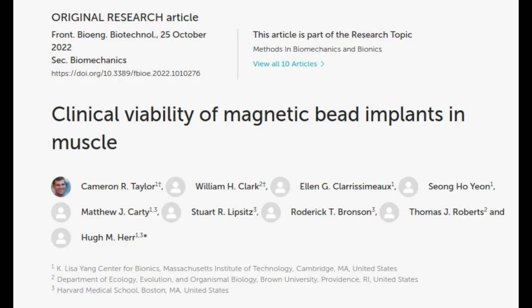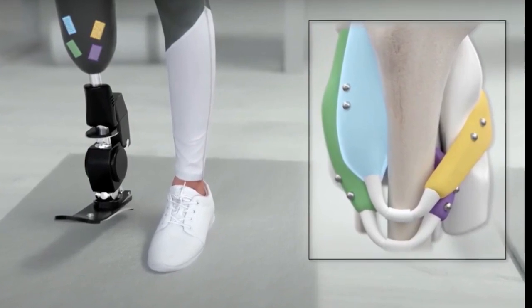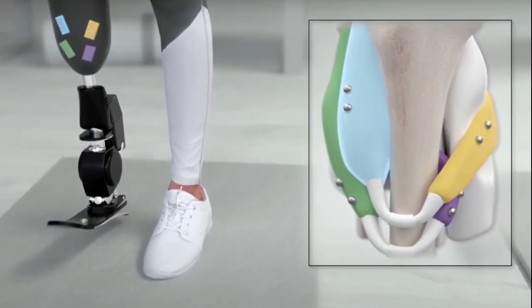In the second paper, the researchers focused on the biocompatibility of the implants. They found that the magnets did not generate tissue scarring, inflammation, or other harmful effects. They also showed that the implanted magnets did not alter the turkeys' gaits, suggesting they did not produce discomfort. The researchers also showed that the implants remained stable for 8 months, the length of the study, and did not migrate toward each other as long as they were implanted at least 3 centimeters apart.